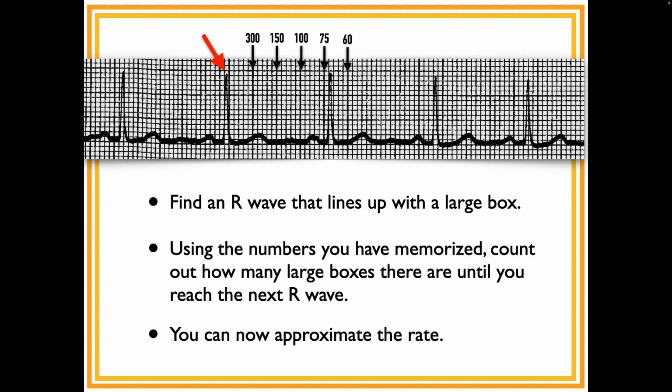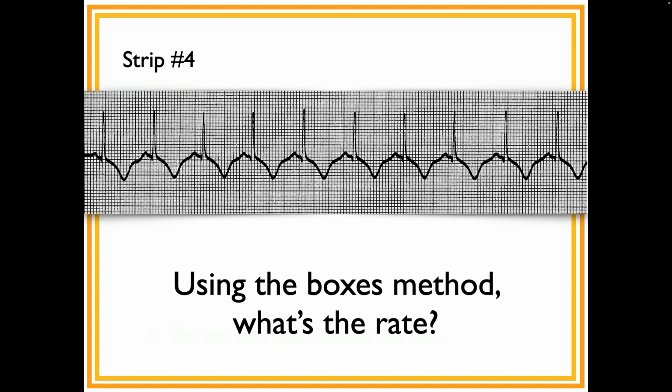Okay. So everybody can do it. Strip number 4, on your handout there. Find one that is close, and then use the boxes method.